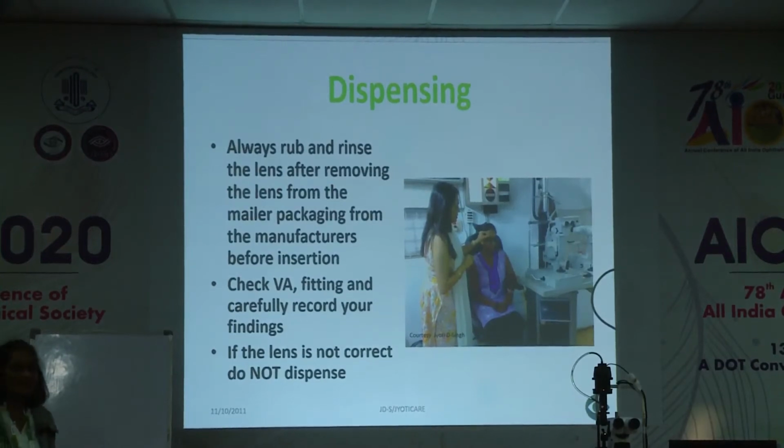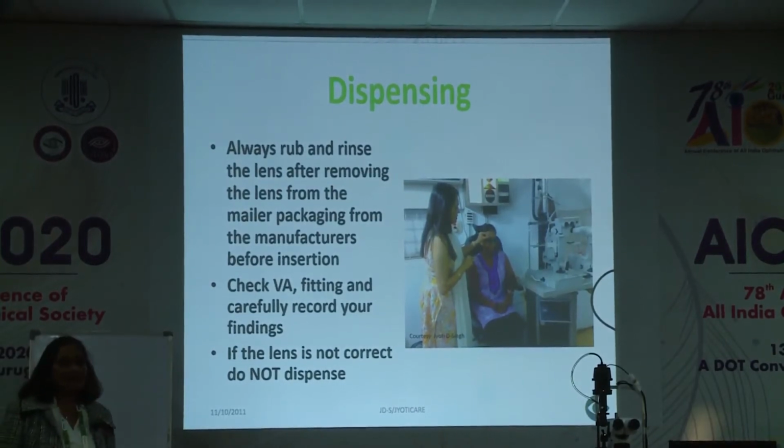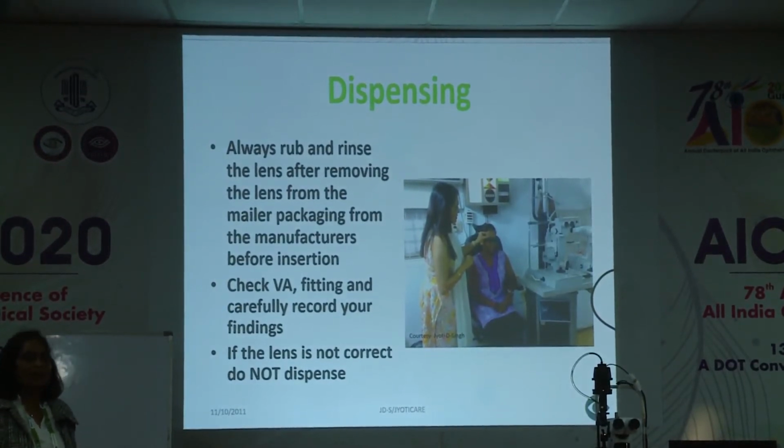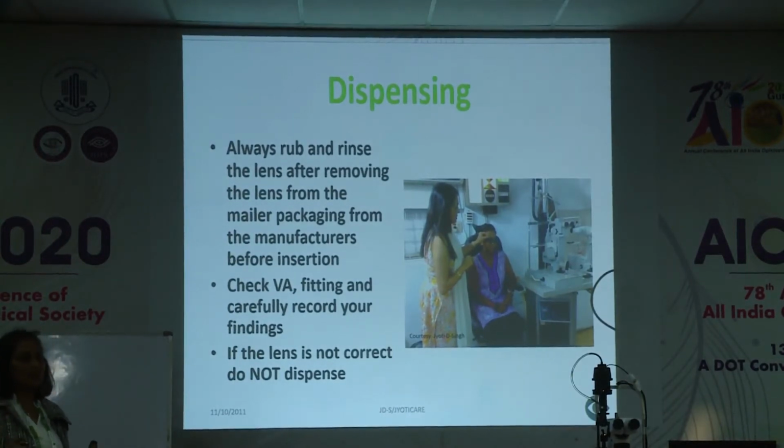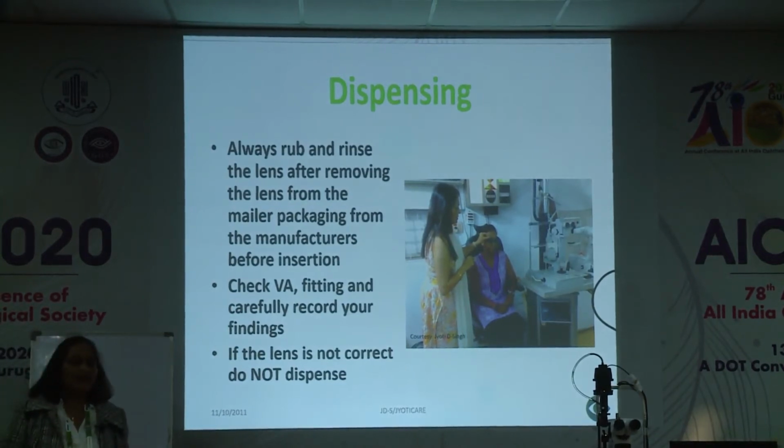At the time of dispensing, please remember that the lens comes dry. In India, because of the transportation problem, the lens will come dry to you, except for the semiscleral lens, that will come wet. But generally the corneal lenses will come dry to you. So before you dispense it to the patient, please make sure that you check that the lens has got the correct parameters that you have ordered, which comes in a little white spec sheet. And once that is established, then you keep the lenses in a fresh case.